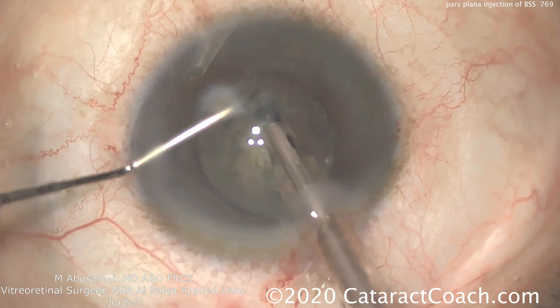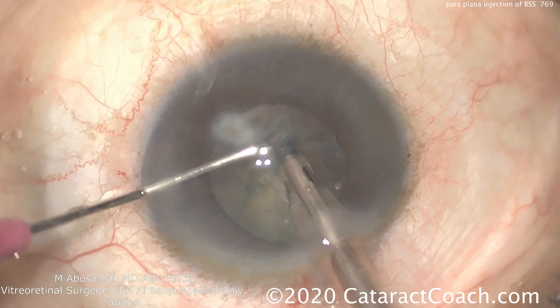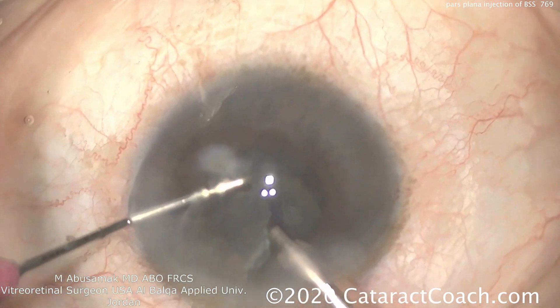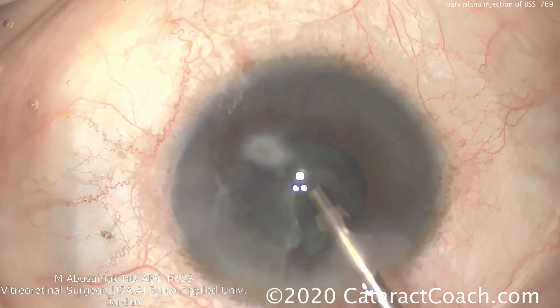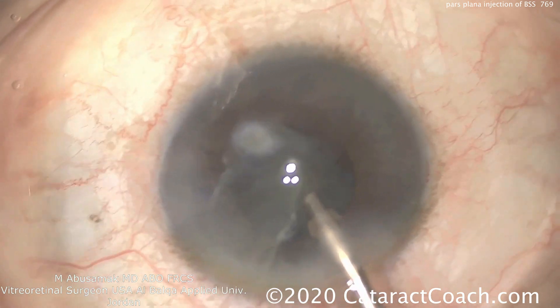It's very important that we take as many precautions as needed in a patient like this who is monocular and relatively young. The nucleus is chopped up into pieces. Certainly not an easy surgery. Now, what do we do about that opacity in the cornea? At this point, really nothing — let's just do the cataract surgery alone.